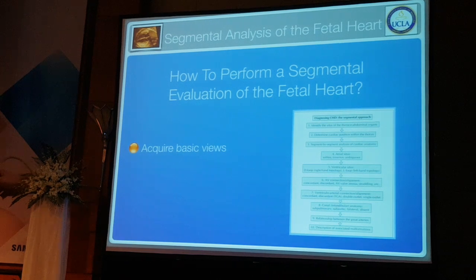So how do we perform this segmental approach? How do we actually do it? Because I talked in terms of theory. How does that translate into practice when you're actually scanning a patient?